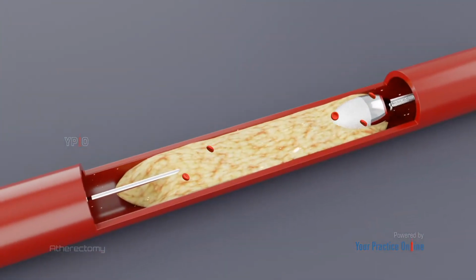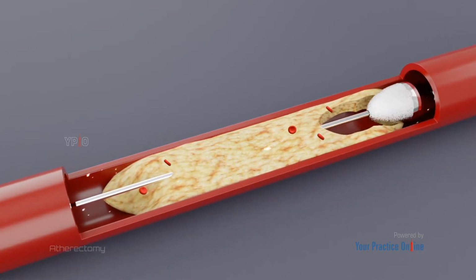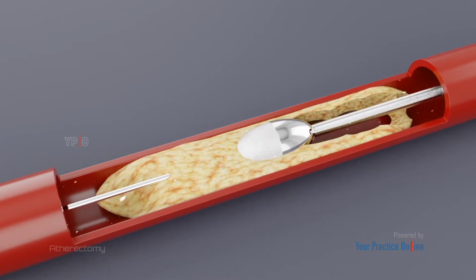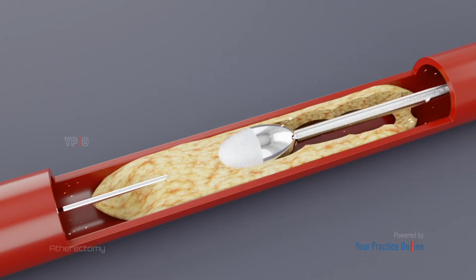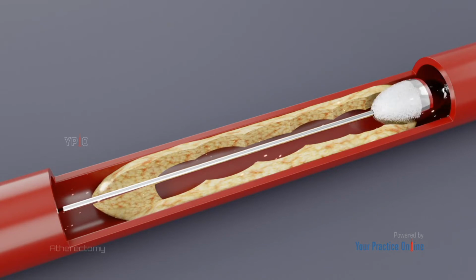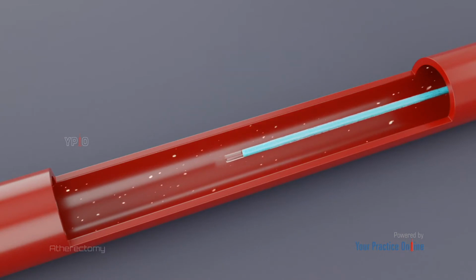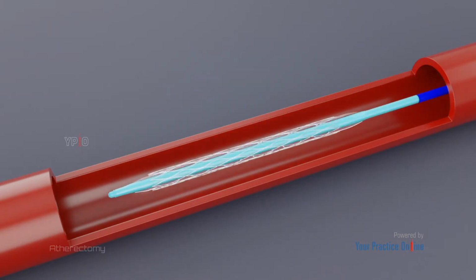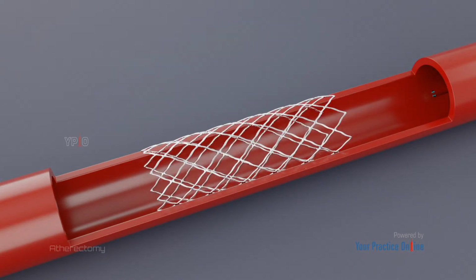Your surgeon then inserts an atherectomy catheter attached with a blade, grinding bit, or laser filament at its tip through the guide wire to the narrowed part of the artery to scrape away the plaque. Your surgeon may pass the catheter several times to cut away major parts of the hardened plaque. A collecting chamber or suction system at the tip of the catheter removes the plaque particles as they are scraped off. Once the hardened plaque is removed, your surgeon inserts a stent, a tiny mesh tube, to support and keep the artery wall wide open, preventing it from narrowing again. Once the treatment is complete, the catheter is removed.